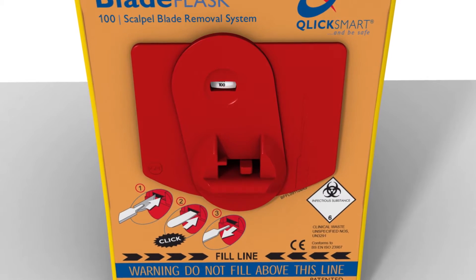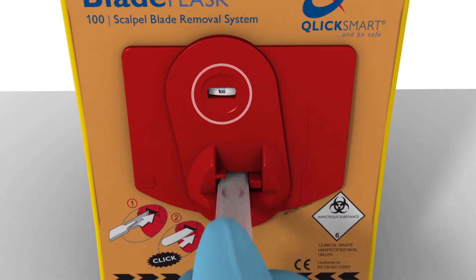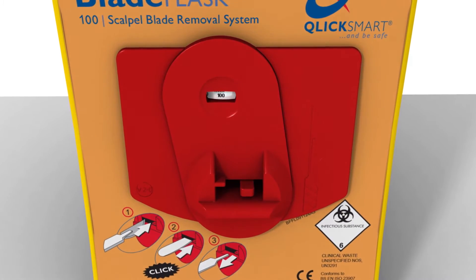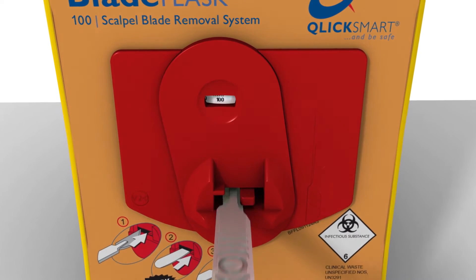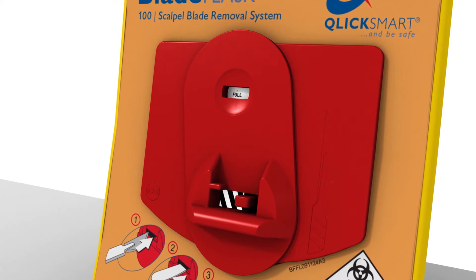Then simply withdraw the handle. As blades are removed, the counter on the blade flask counts down from 100. Once the counter reaches full, it automatically shuts off, which prevents overfilling.